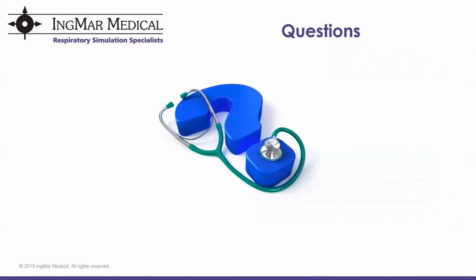And so in the configuration that I believe you have, that USB monitor cannot be connected wirelessly. We don't have a way of doing that. So that monitor that we included with your system would need to be connected by USB. Of course, if you want it to be considerably far away from your instructor computer, you could use a long USB cable. Alternatively, you could really use any extended display that you have available to you. So if your center has monitors or audiovisual equipment that you want to incorporate, that can certainly be accommodated.